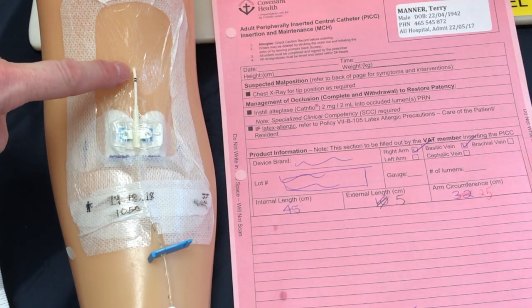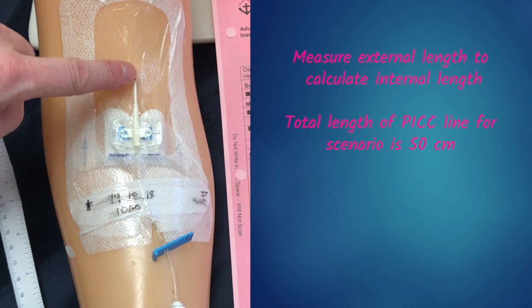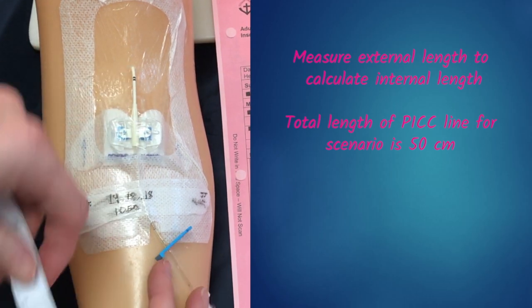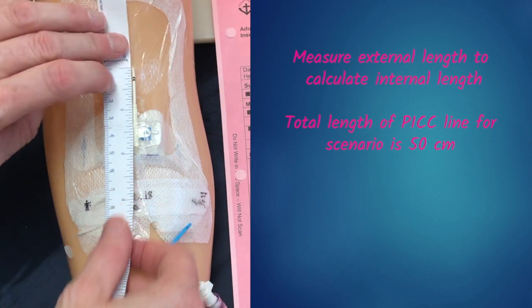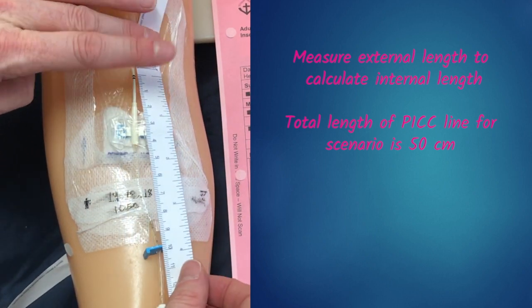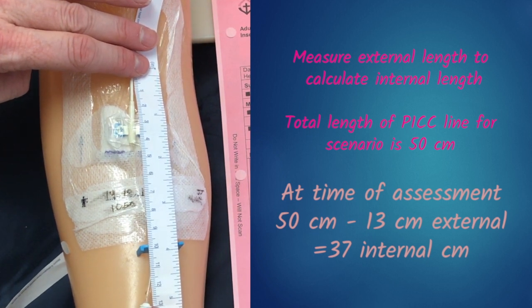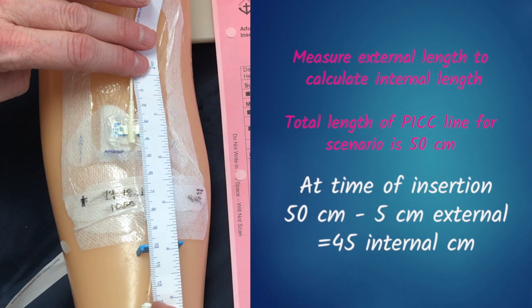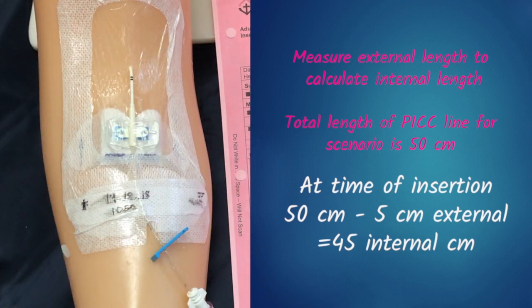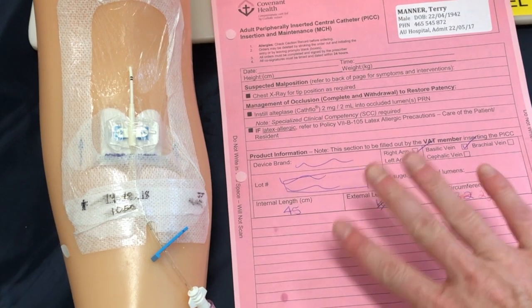We still have two more measurements to confirm: the internal and external length. You may find notches and numbers on your line, but if you can't read them, use your measuring tape from the insertion site down to the catheter hub in the straightest line you can make. Here we're at 13 centimeters. If the original external length on the document was only 5 centimeters, this line has been dislodged, and again your actions will depend on your agency policy.